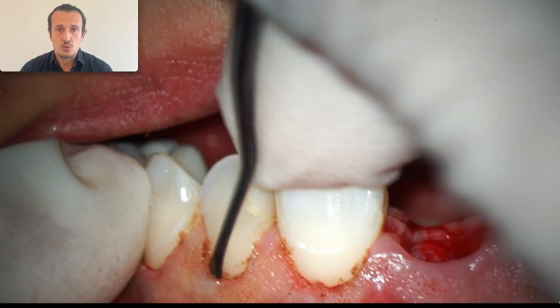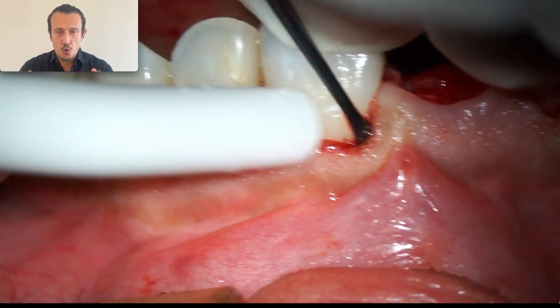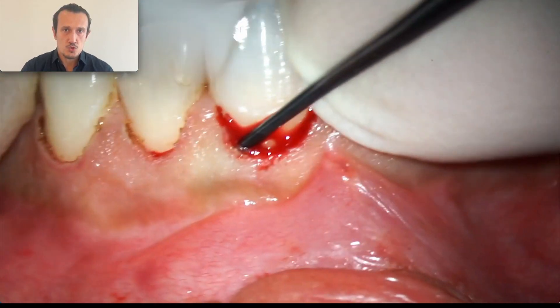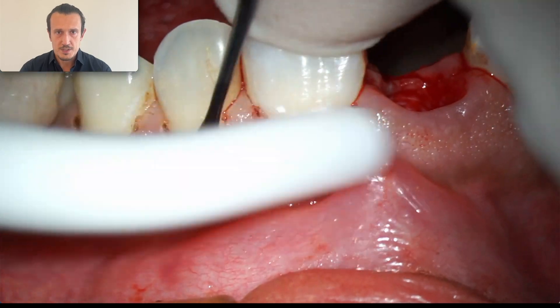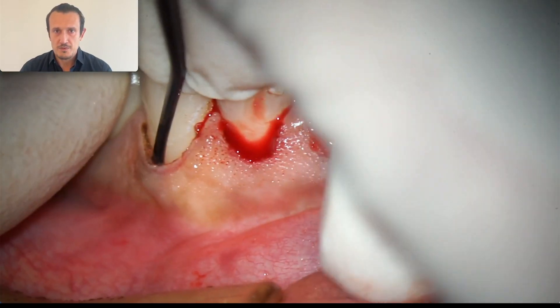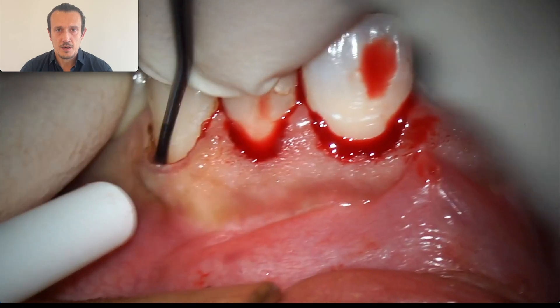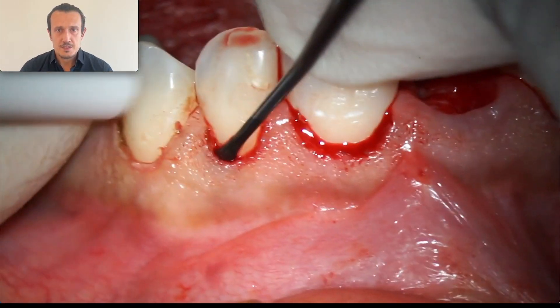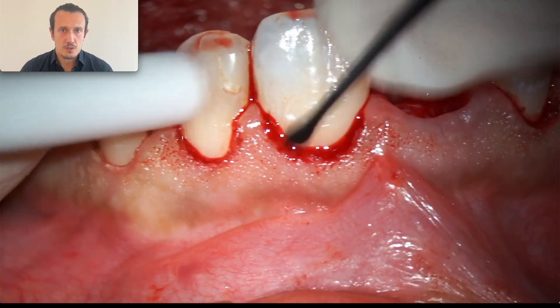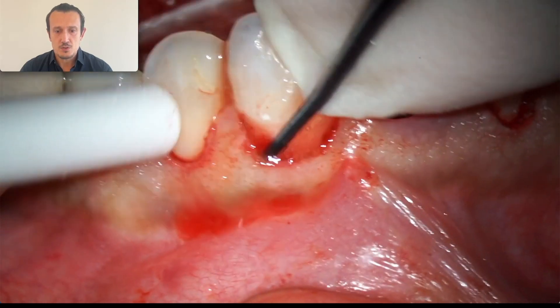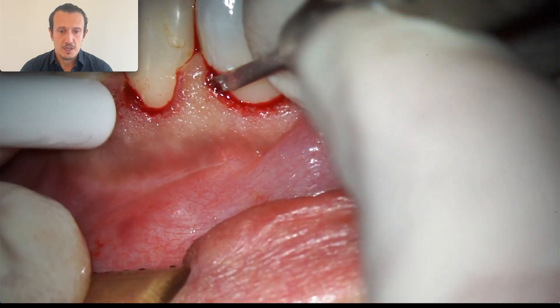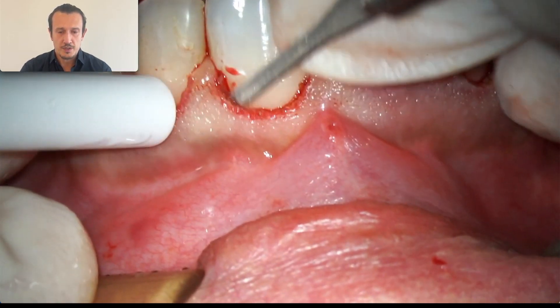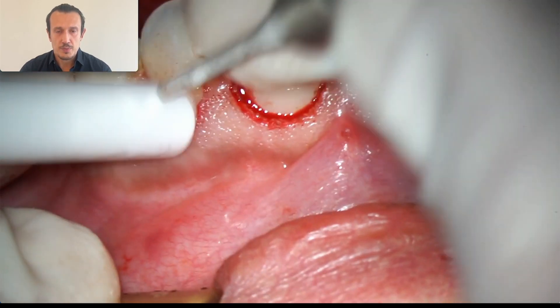In order to perform the bone part of the crown lengthening, I'm going to raise a small tunneling flap to be able to access the bone without damaging the soft tissue with the burr or curettes. Nowadays I'm using piezo devices like VNH, and with this I'm able to perform it even easier — but back in the day I needed to use manual or rotating instruments. For this I need to create a small tunneling flap; you can see here with the blade I'm just releasing the papilla to have access to the bone.